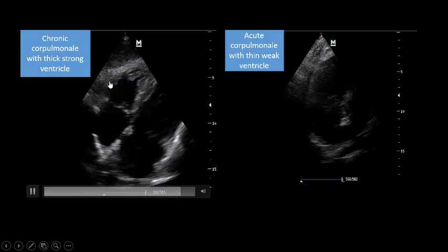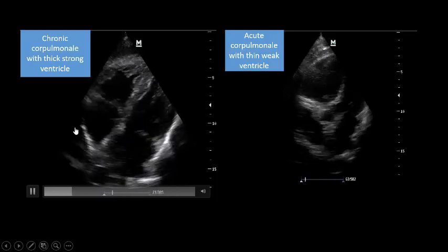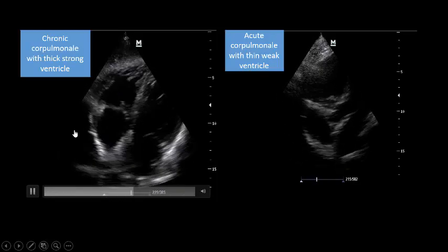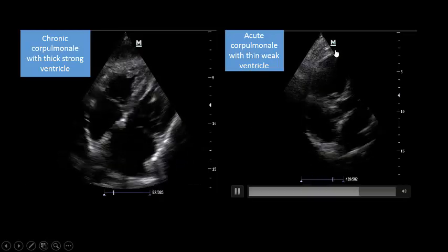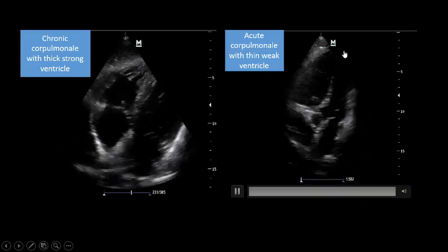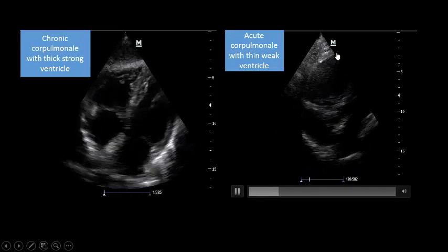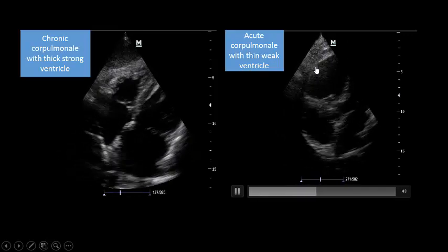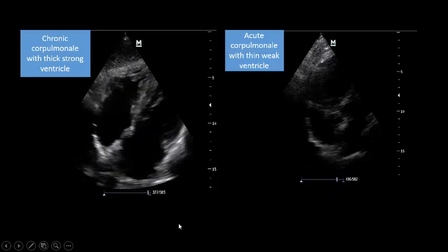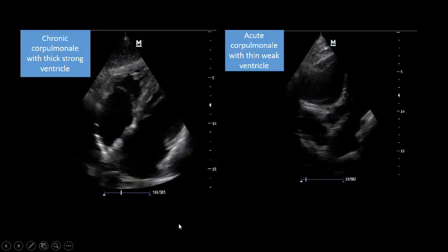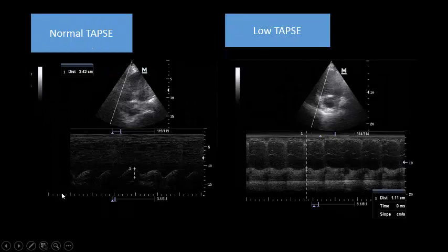The strong chronic RV shows a visually robust TAPSE — strong up-and-down movement — compared to the poor movement of the acute cor pulmonale RV. You can measure this quantitatively: normal TAPSE in the chronic compensated case versus a low TAPSE in the acute case due to poor right ventricular contraction.